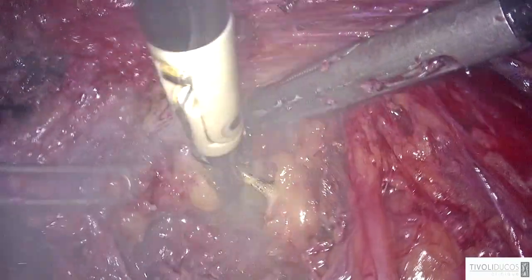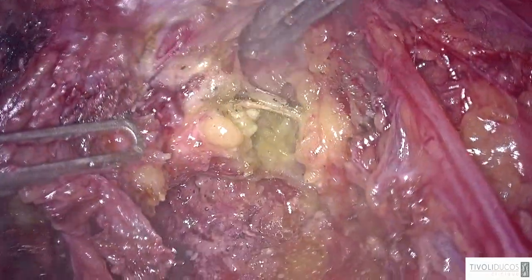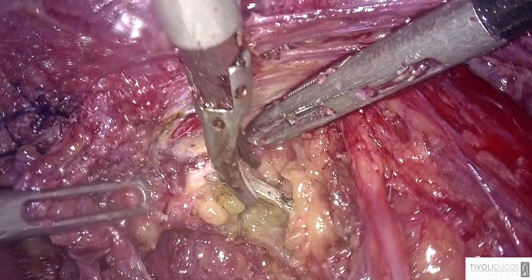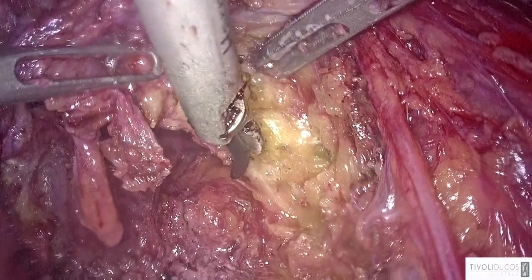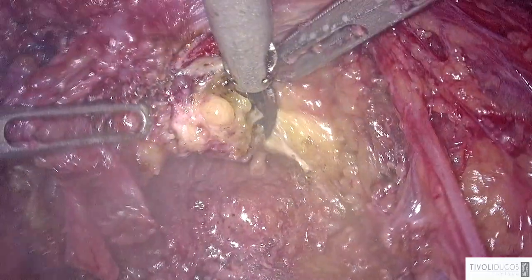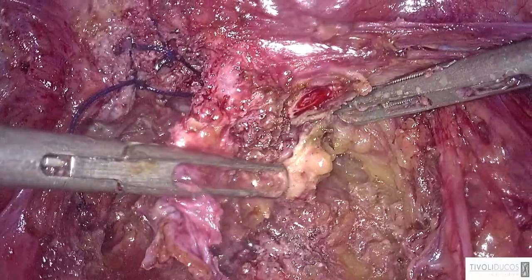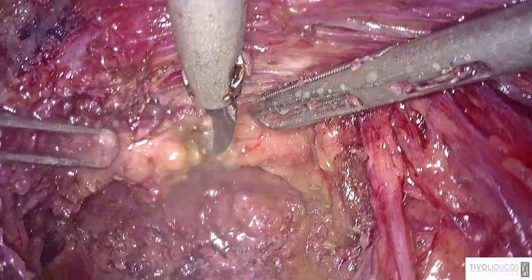We also have to try not to coagulate too much, because even though the nerves are preserved, you can injure them with the thermal effect of coagulation. Honestly, I don't think that nerve sparing means dissecting the nerves completely, because in this case I think we can take the risk of injuring them by simply coagulating vessels. So I look at them to know where they are, and I dissect them only if they are actually in the plane of my resection. Here we have another vessel.